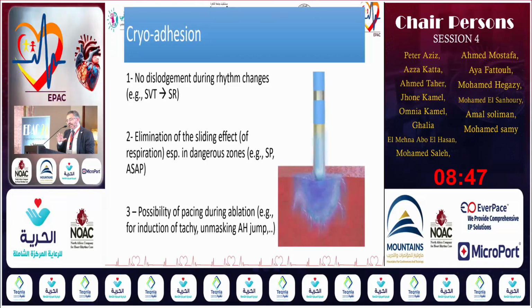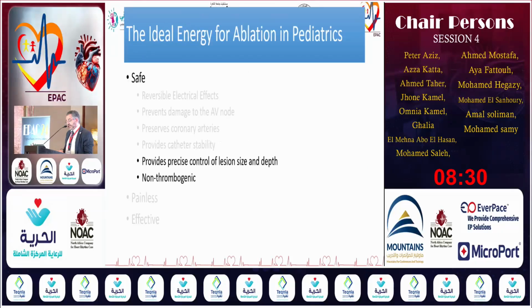And actually, as a demonstration, when we do cryoablation, once we reach cryo-freeze, within like 45 seconds, you just leave the catheter and it stays where it is, even if you're not holding it. And it will stay there until you thaw the temperature. So this is an additional feature for safety.